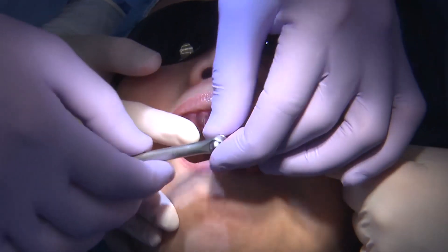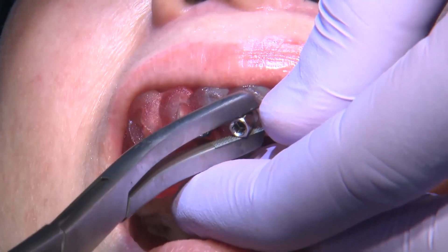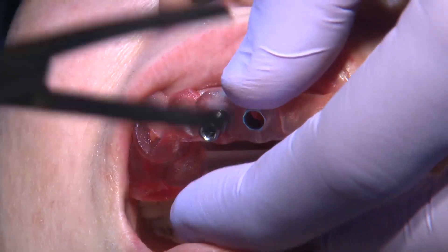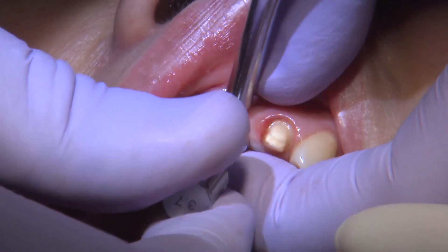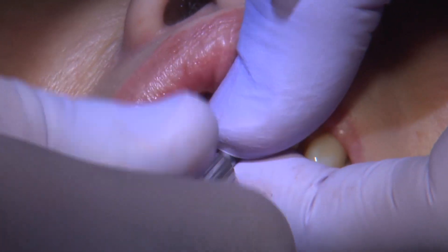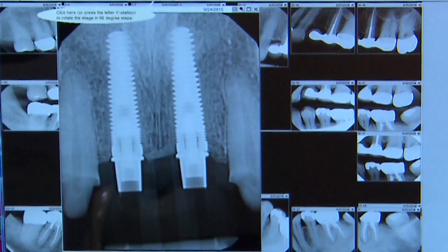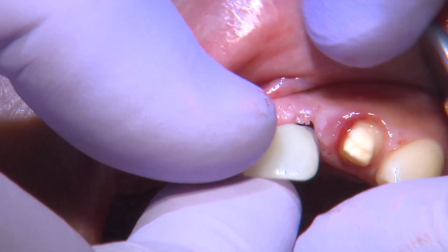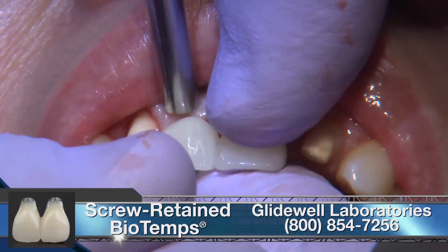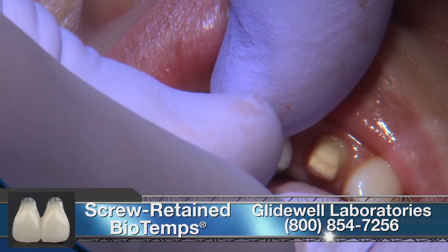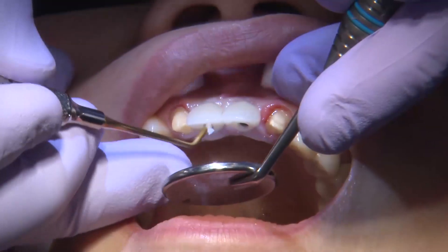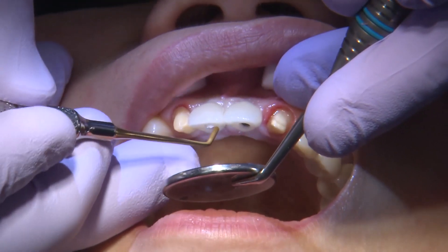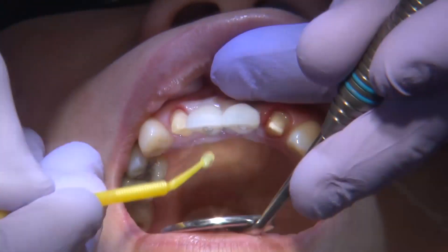Another advantage of utilizing digital treatment planning software is that we can do a digital wax-up based on the proposed implant position, and I can ask the laboratory to fabricate screw-retained biotemps. In this case they are splinted together to give a little more stability between the implants. This is a factor of being able to precisely place the implants — if they aren't precisely placed, you'll have issues getting a temporary like this to sit on top.